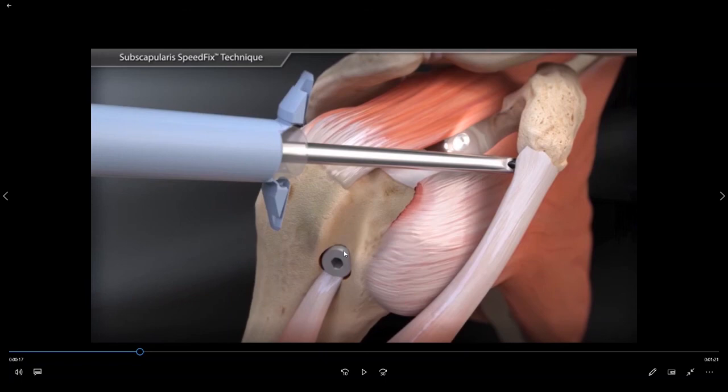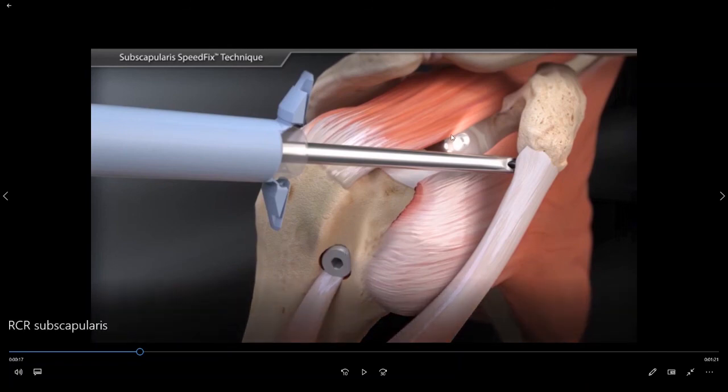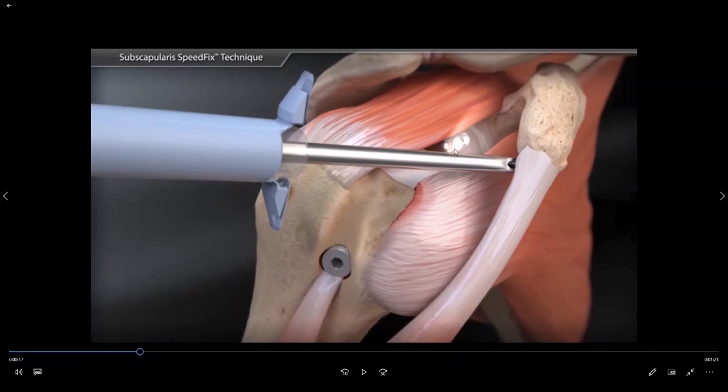The other option for the biceps tendon is a biceps tenotomy, where the tendon is simply released. For more information regarding the advantages and disadvantages of a biceps tenotomy versus tenodesis, please see my video on biceps pathology.